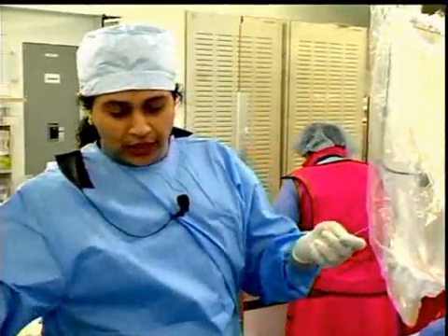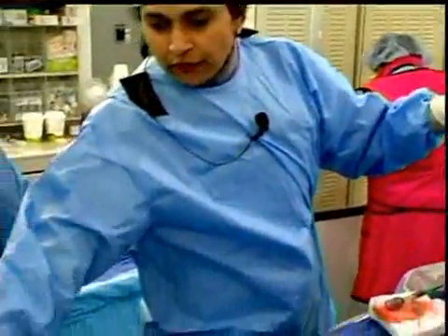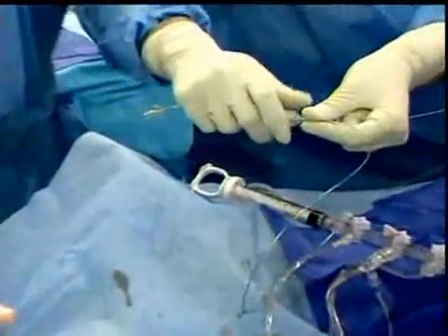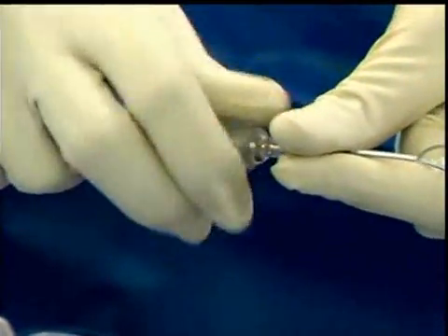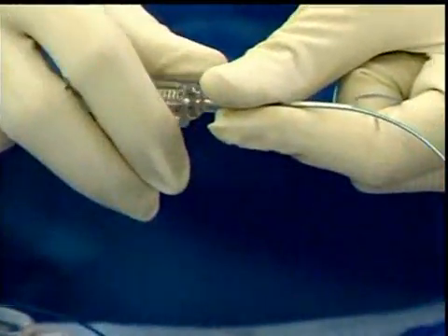Now I have the Venture catheter ready here. I have taken the over-the-wire Venture, if you see it, and as you see, this is how it happens. Clockwise you can change, and when you counter the angle, the tip that's deflected becomes straight.